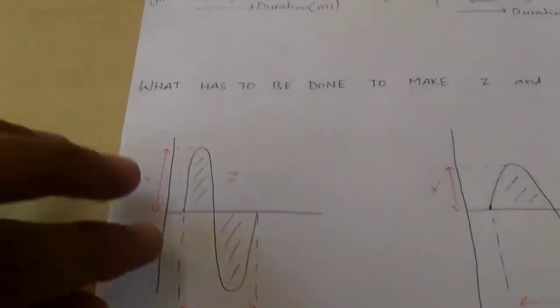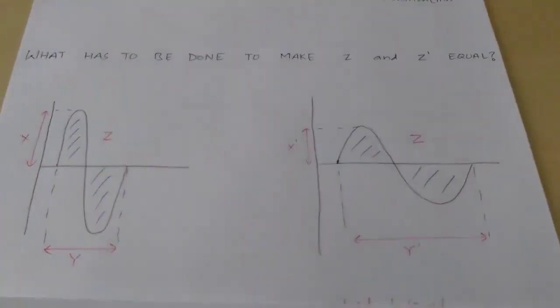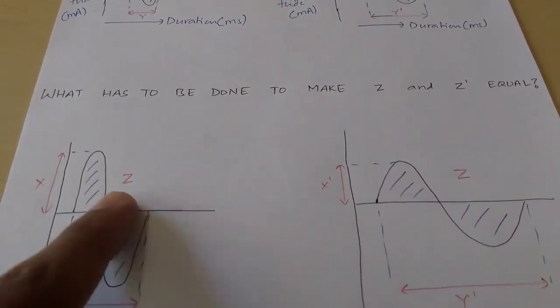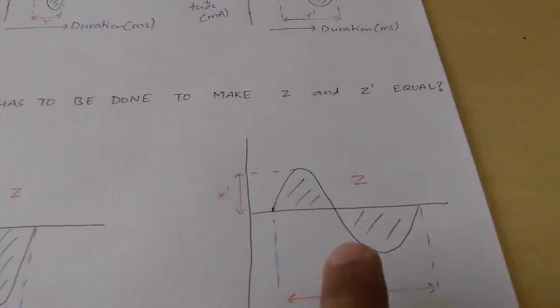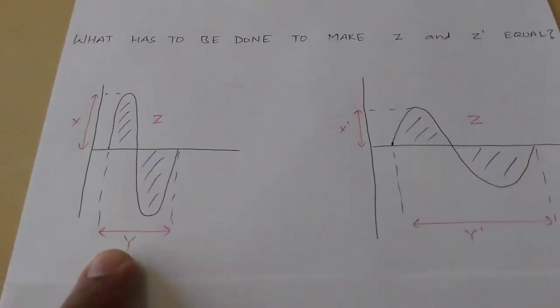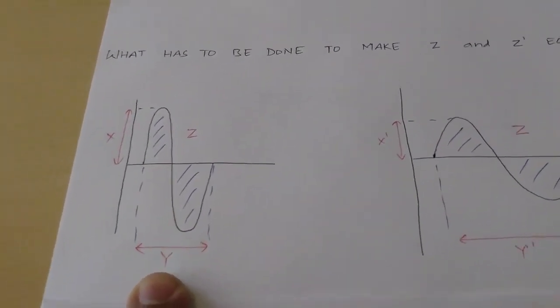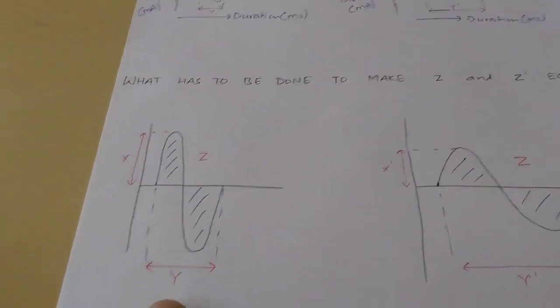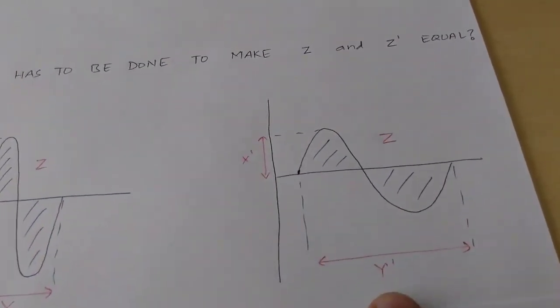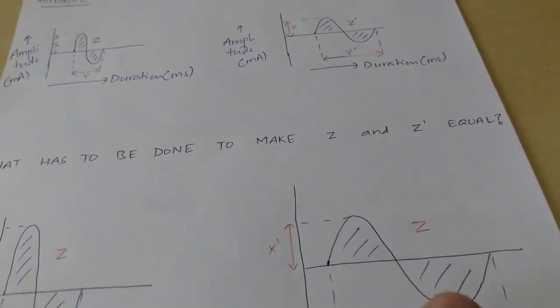Now in this case, we have obtained an equal amount of charge getting transferred into the tissue. The area has increased, and here we can see the area has increased. The pulse duration, as we know, is smaller for Faradic current. It is longer originally for galvanic current.